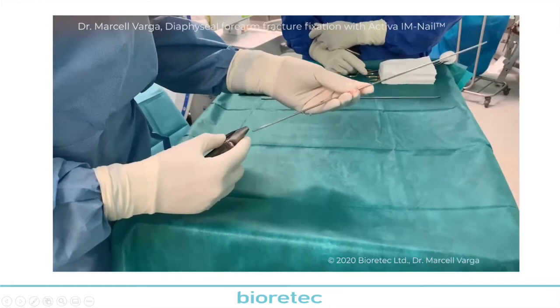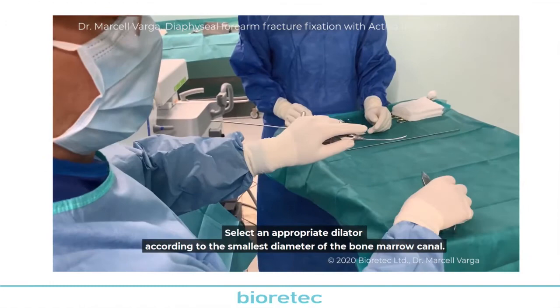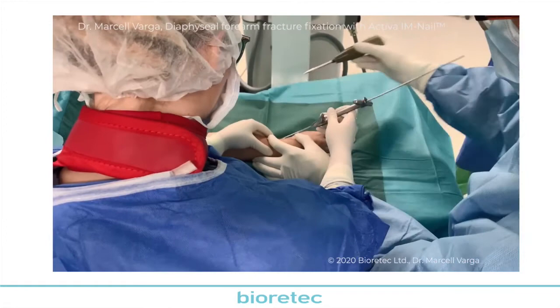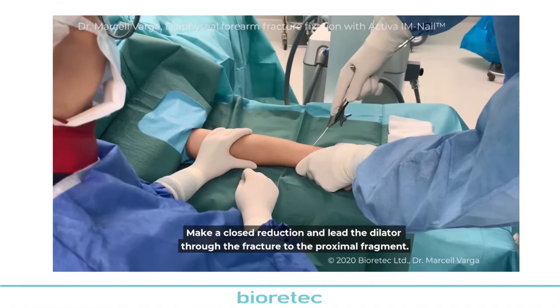After we open the medullary canal, we set this so-called dilatator. It is almost the same as an elastic titanium nail, but it is not made of titanium. It is a metal alloy nail. I can bend it. It is almost as elastic as a titanium nail. And the importance of this dilatator is very great, because first, with this dilatator, I make my reduction similarly as I would make with an elastic nail.